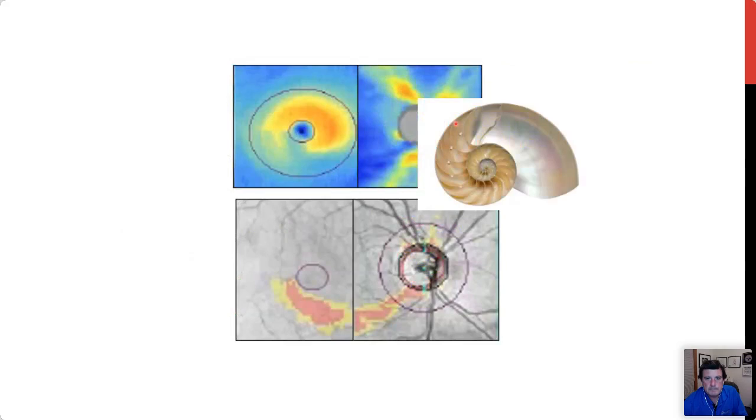And as we can see, these are continuous defects, the effect of the arcuate bundle going from the parapapillary area right through to the macular zone, that horizontal cut, that pseudo nautilus shell appearance to me on this device has always been very, very compelling for early disease.